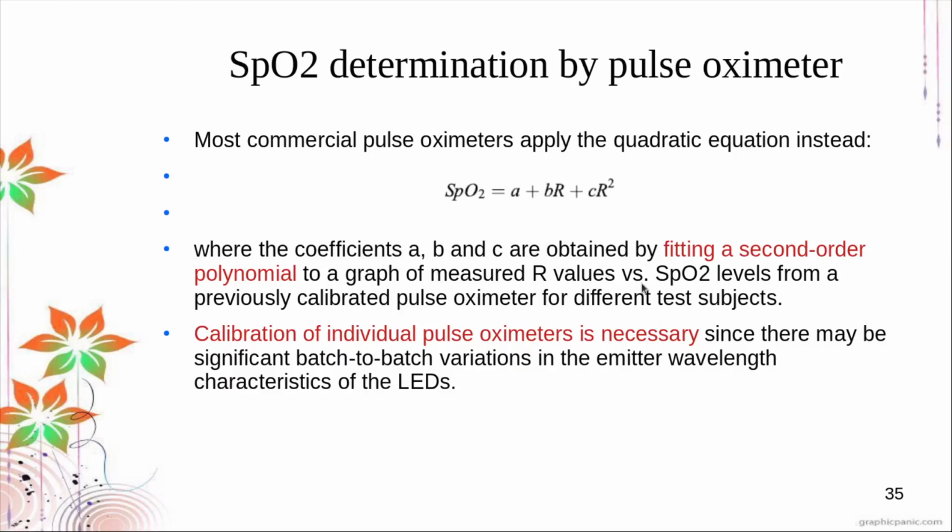If you notice, when you first apply the SpO2 sensor, there's a lag time between attaching it and getting the readout for your blood oxygen levels. That is because the oximeter is actually calculating your SpO2 level from the light intensities.